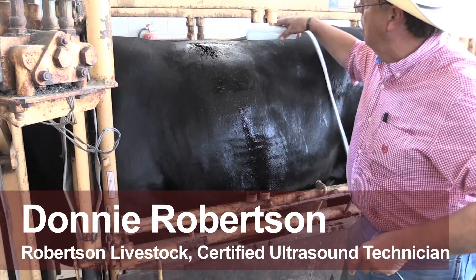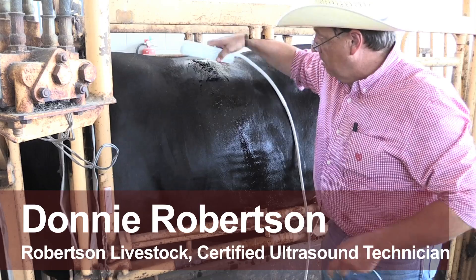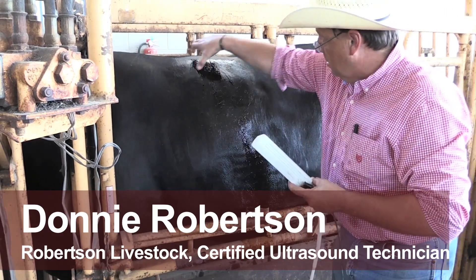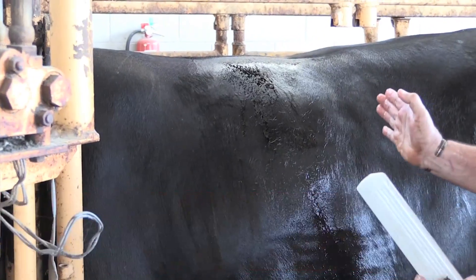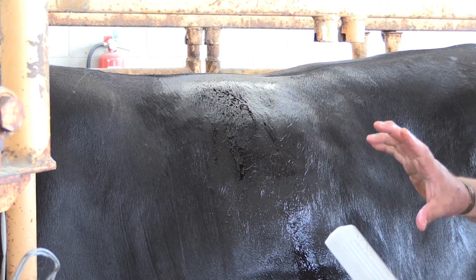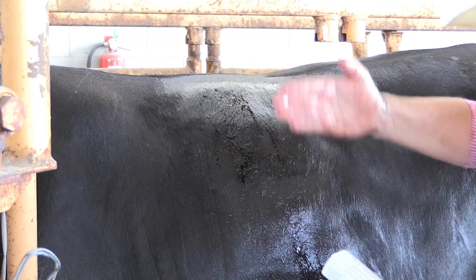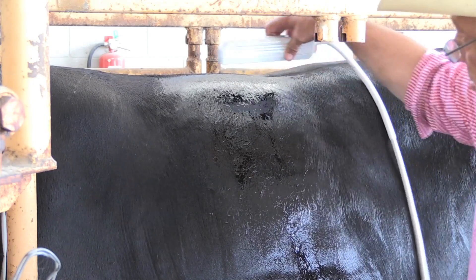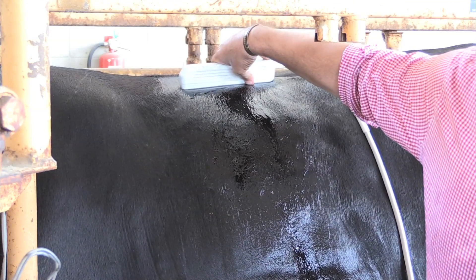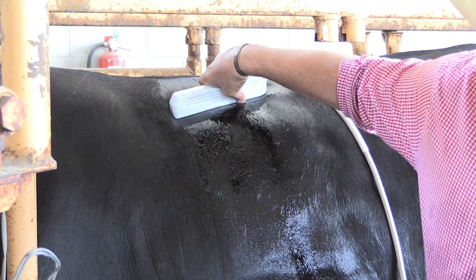Now to measure marbling, we're going to lay it right across the top of their back, right across that muscle. Picture if this was a log. If you were measuring rib eye area, you just cut the log in half and measure the total face of that log. For a marbling image, we're going to be splitting that log long ways and shooting straight down through it, so we'll get a bigger surface area for measuring our intramuscular fat.